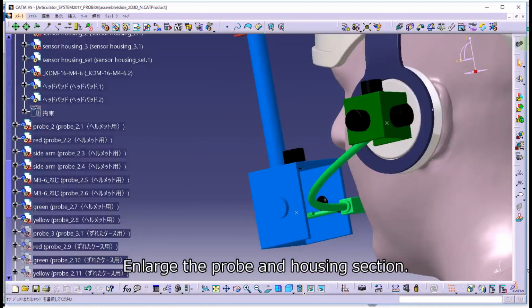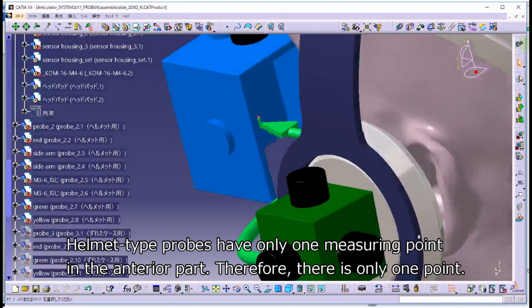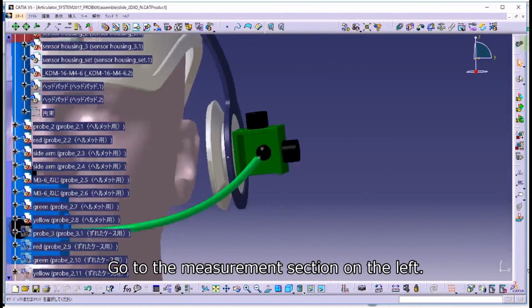Enlarge the probe and housing section. Helmet-type probes have only one measuring point in the anterior part. Therefore, there is only one point. Go to the measurement section on the left.